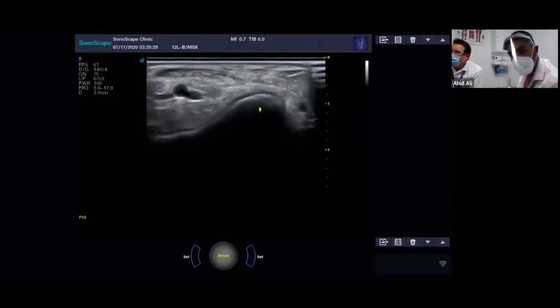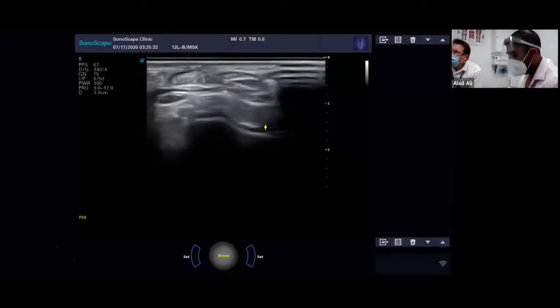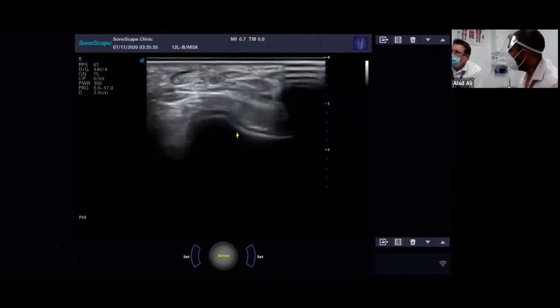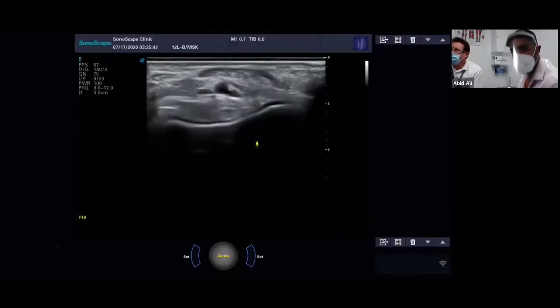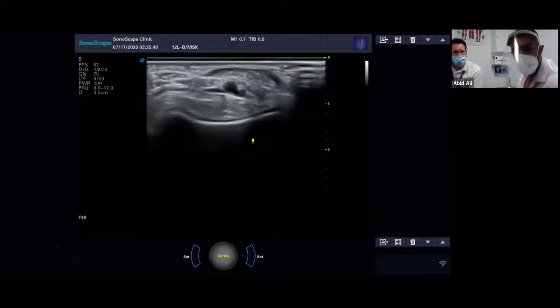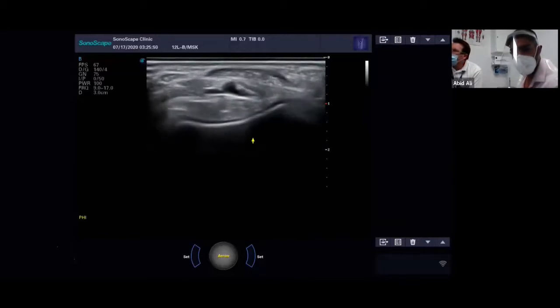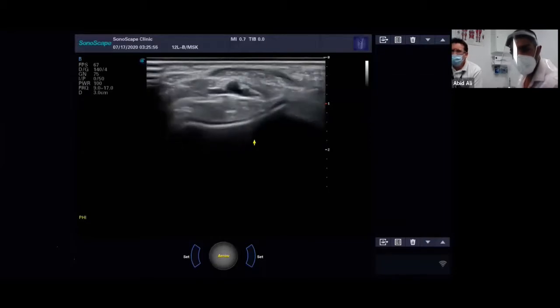Quite common, isn't it? Yeah. You'll also sometimes see some kind of floating little calcific deposits around. You know, there's little sort of bits that come off through natural degeneration, wear and tear, or sometimes injury. Actually, if we get a chance, we'll have a little look at Adrian's lateral ankle, because he actually did have an avulsion fracture, and it'll probably be quite good to show you a bit of real pathology there.